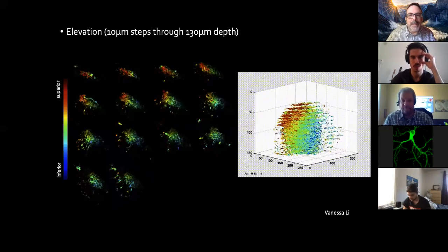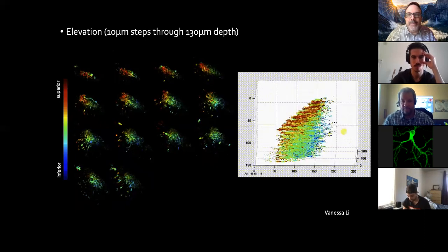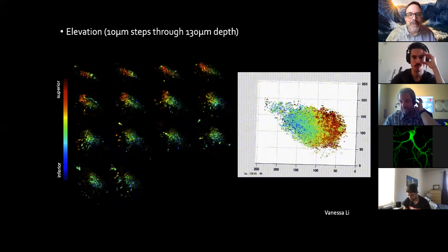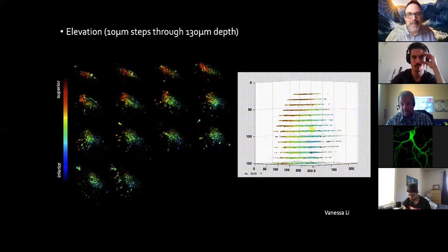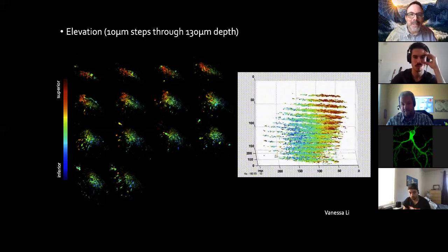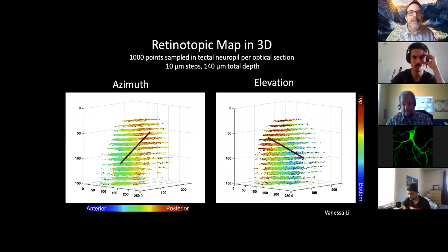This is the elevation map in that same animal. For me, this is hard won data. I've been wanting to get this information for years and years, and it was really only GCaMP6 that made this possible. I think that as these indicators improve, it becomes almost trivial to get this kind of data that we struggled to get in the old days. So they're the two almost orthogonal axes of azimuth and elevation represented in 3D. I'm really happy that we were able to get this information.